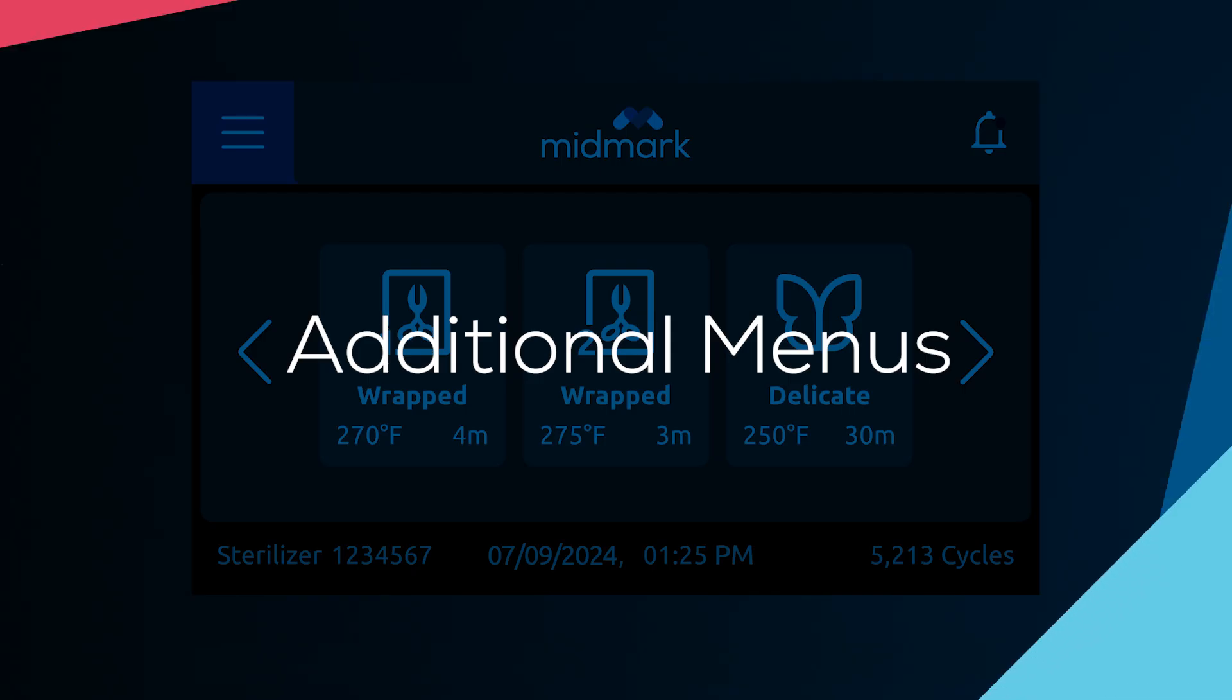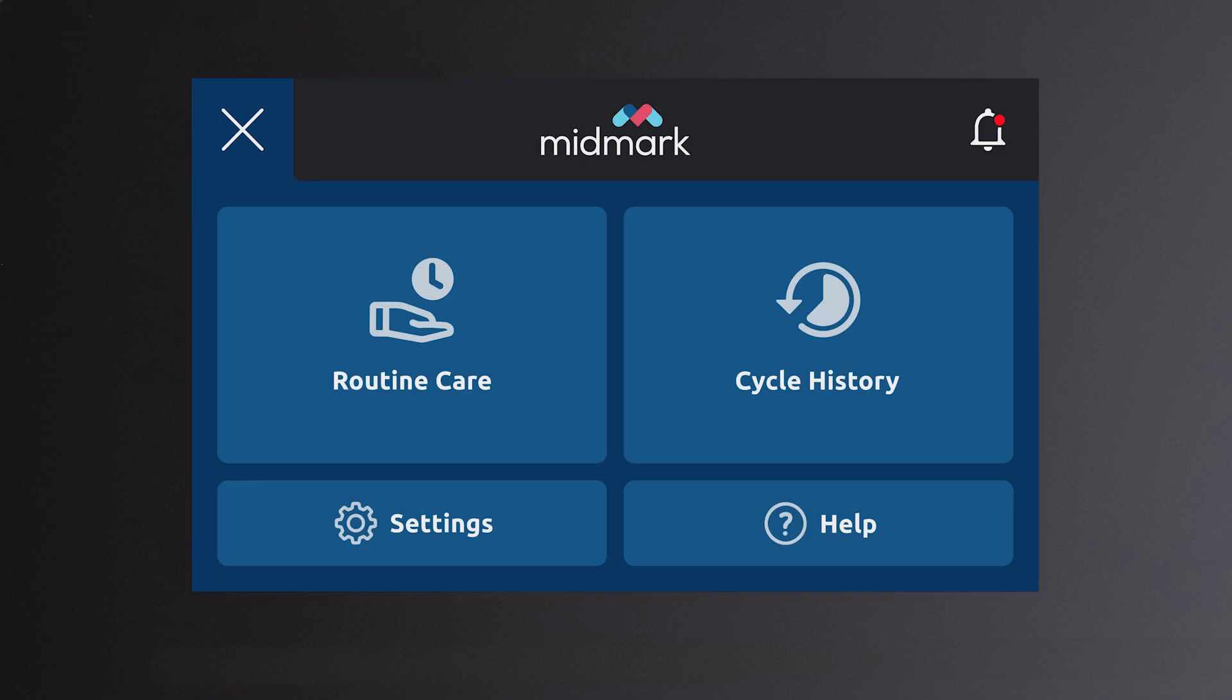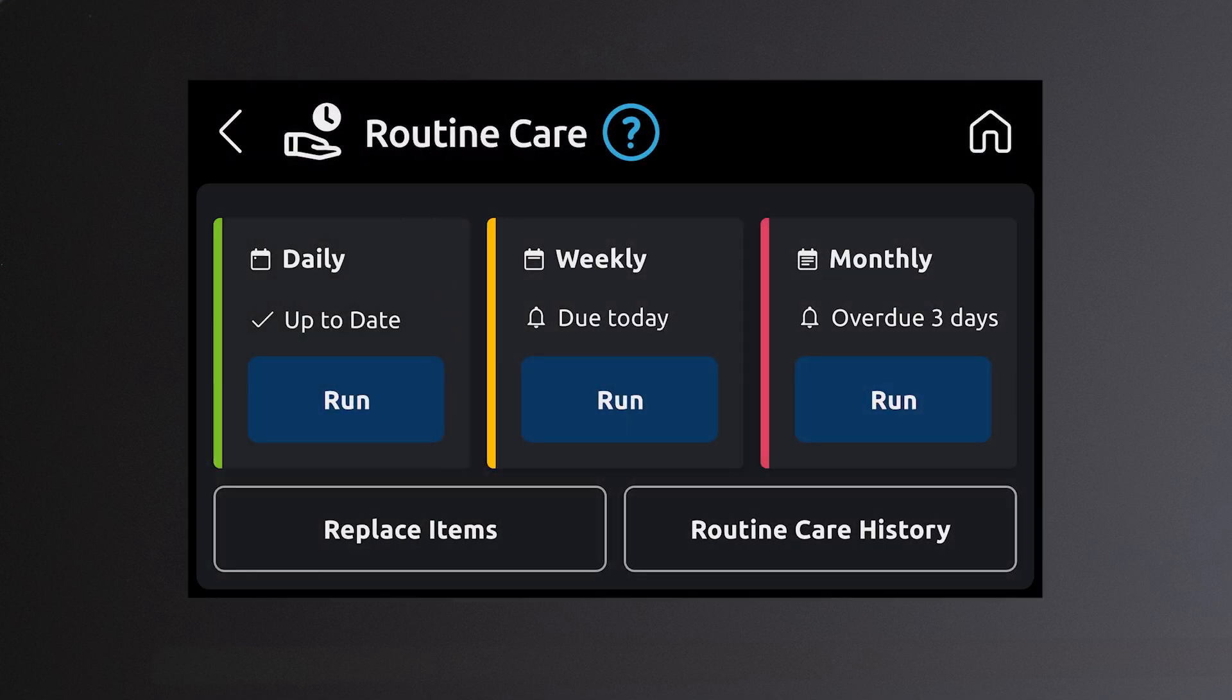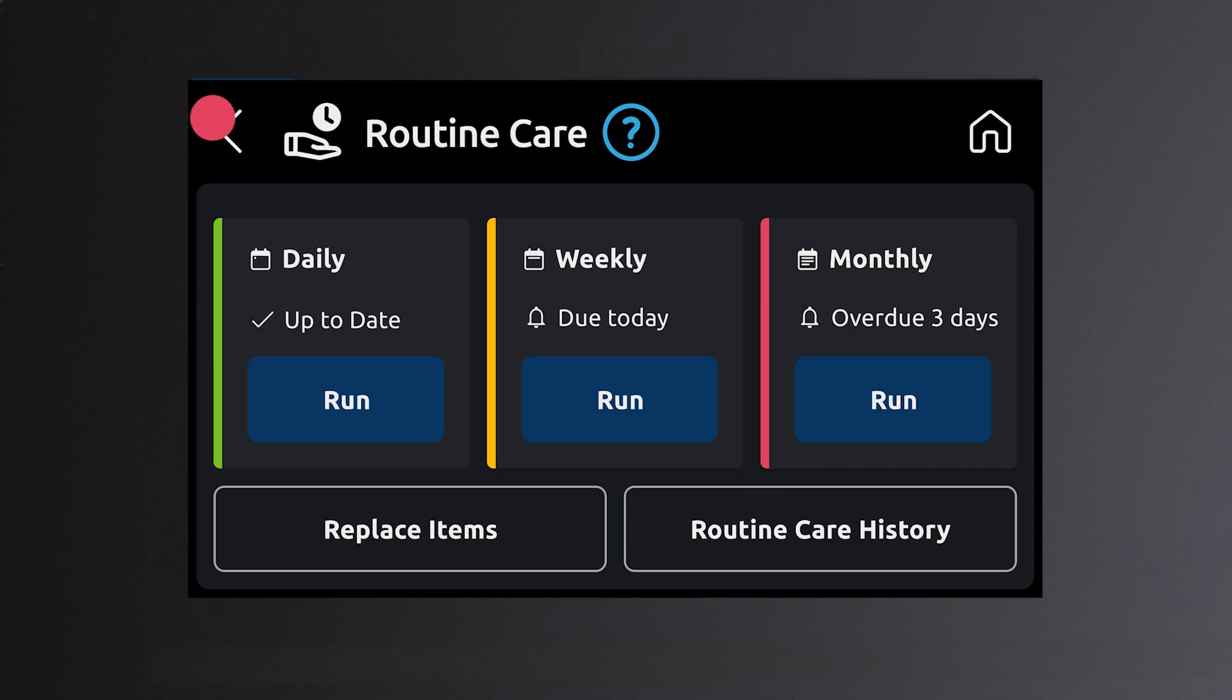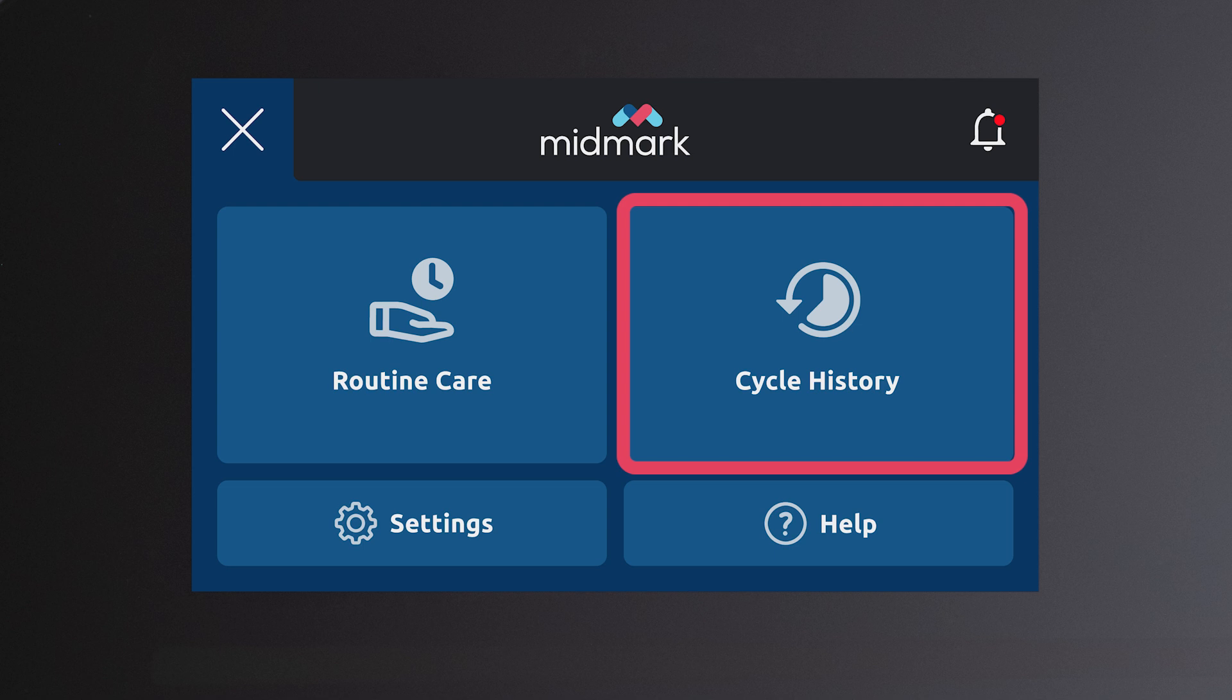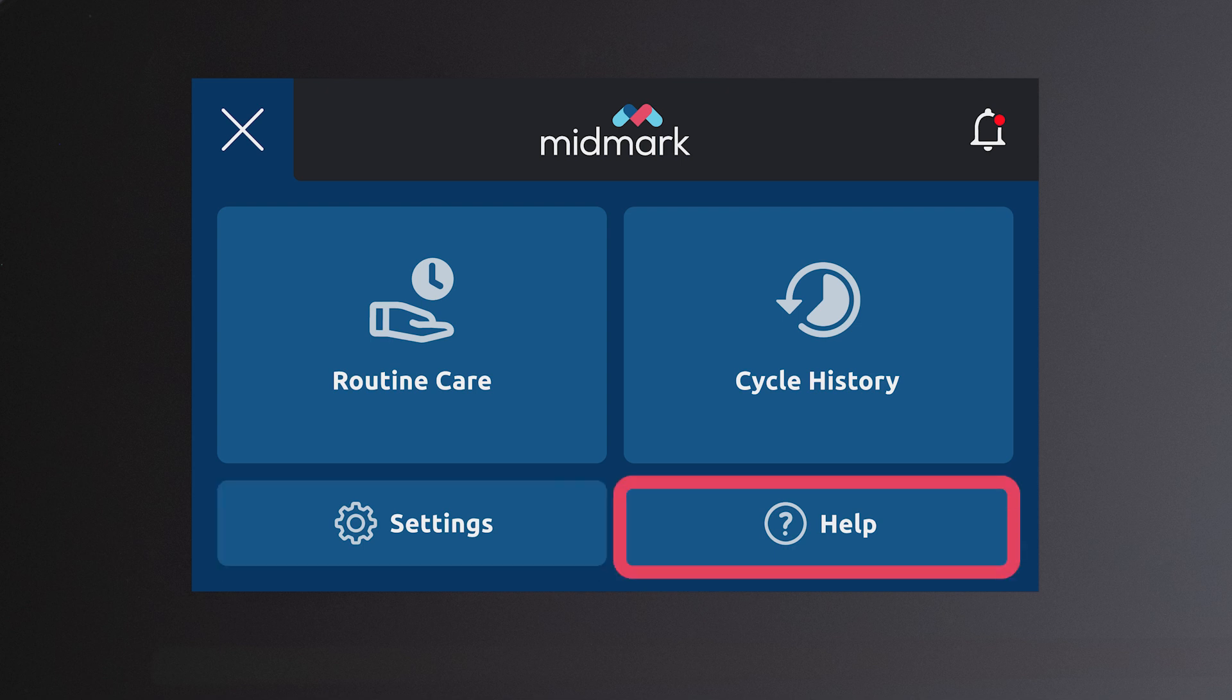Additional menus. Pressing the menu items icon will give you access to the following information, menus and settings. Select the routine care icon for information pertaining to routine care and sterilizer status. The cycle history icon displays cycle history information. The settings icon provides access to the settings menu. The help menu icon provides access to available help topics.